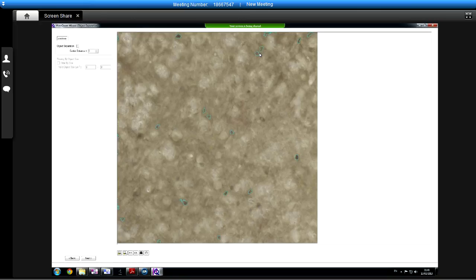And so what you say is if that distance is over a certain number, you consider that and separate them out as two objects. So that works nicely where you've got nuclei sitting on top of each other. And then if you do that, there's just a second filter by size here, exactly the same as this one here. But obviously you can imagine if you separate things out, you might then need to filter by size, either by different criteria, or more often than not, just by the same numbers as before.